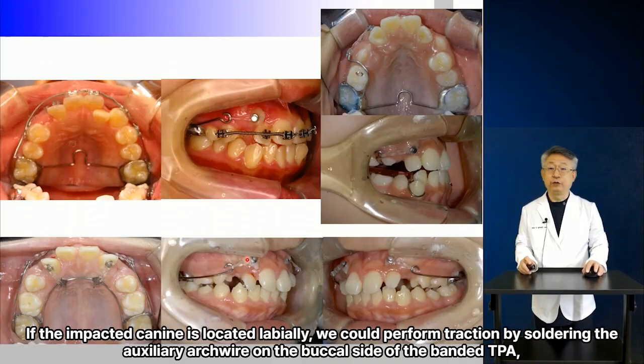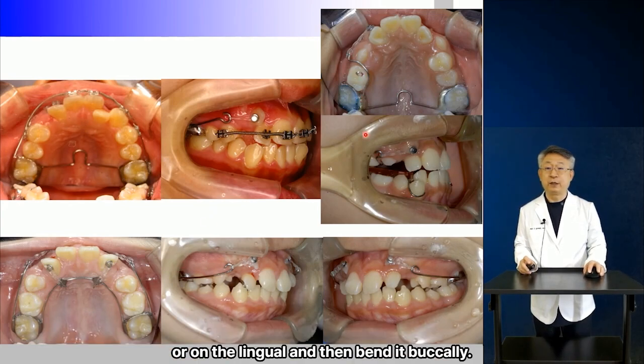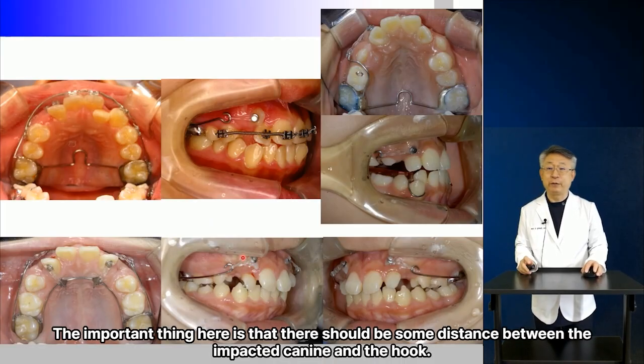If the impacted canine is located labially, we could perform traction by soldering the auxiliary arch wire on the buccal side of the banded TPA, or on the lingual and then bend it buccally. The important thing here is that there should be some distance between the impacted canine and the hook.